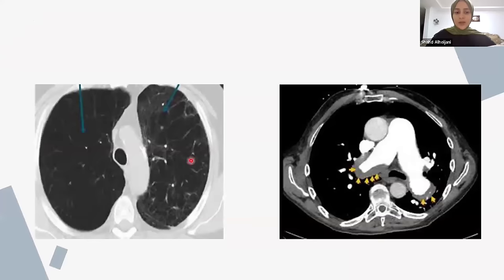So for example, here we have the lung window. If you have any abnormality in the lungs, you can see it. For example, fibrosis, anything going on, dilation. So the lung will be clearest. Meanwhile, if you have abnormalities here, you can't really see them. You can't tell. So this is the lung window.